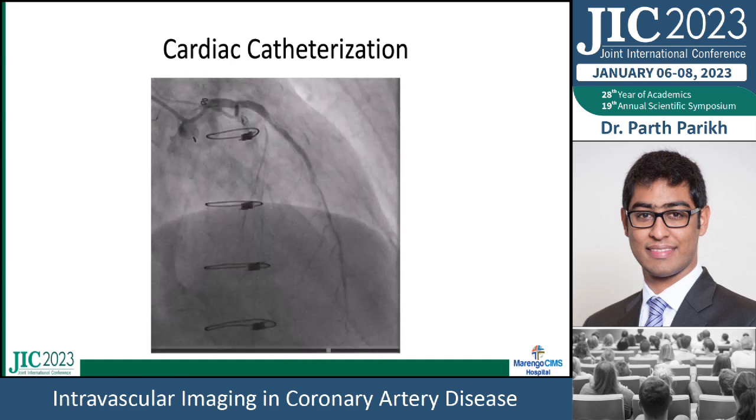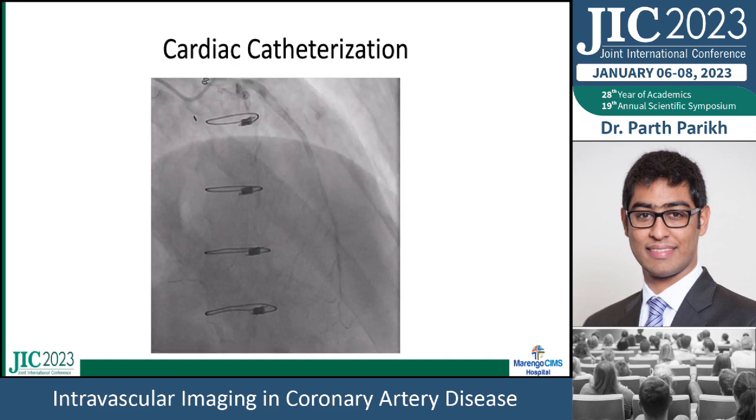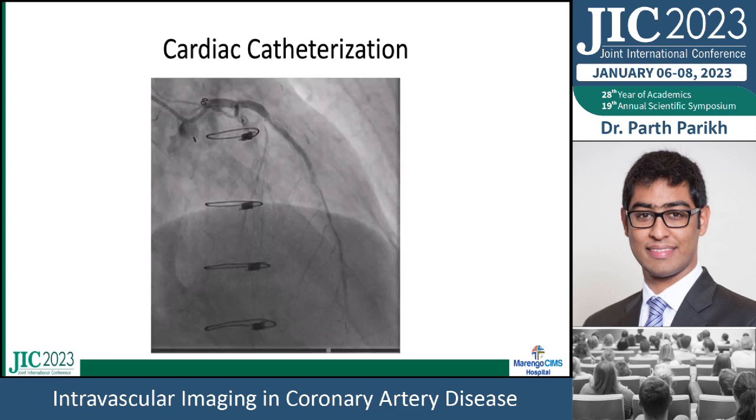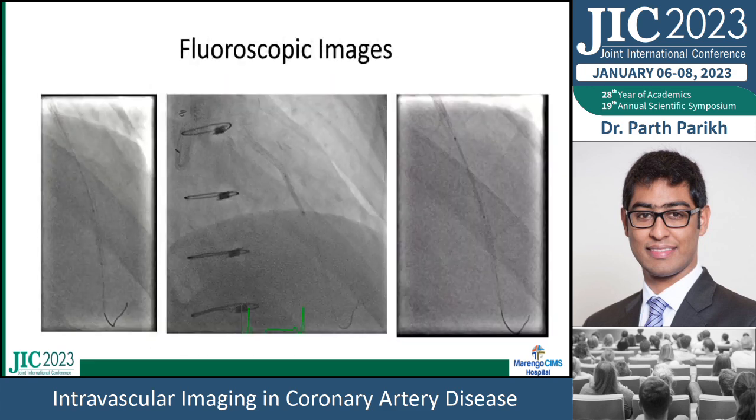So what do we do? Do we let the patient write in pain or just medically manage, or can we do this with no contrast or use contrast and have the patient end up on dialysis? So this is where we use IVUS.